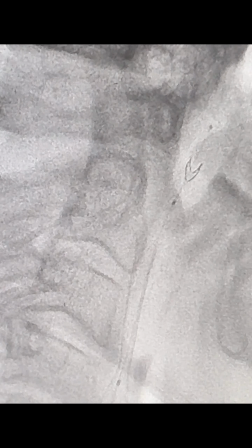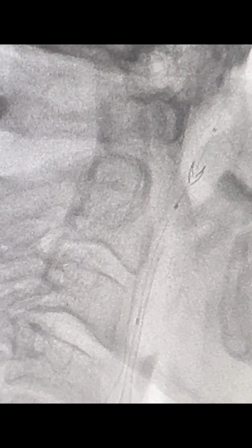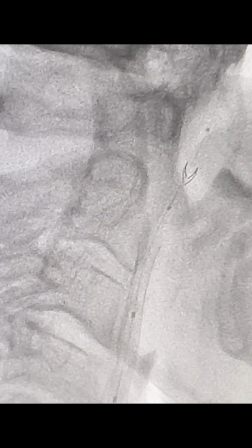across the same lumen. The balloon is coming. Yeah, this is the balloon which is across the constricted segment, and we are doing a very gentle angioplasty. So you can see the dilation of the stent. Now the stent is well dilated, and we can see the flow to the intracranial circulation very well.